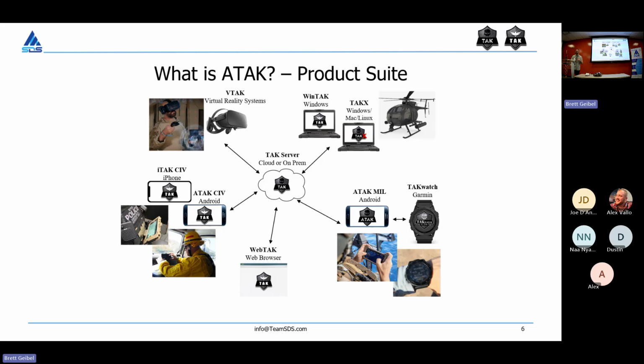The commander back at headquarters now has access to a TAC server and can see the situational awareness of everything that is going on across a whole theater of operations, as opposed to something limited to, you know, a small town or something that's going on. This will become very important when we begin talking about the benefits of ATAK in the medical devices field.